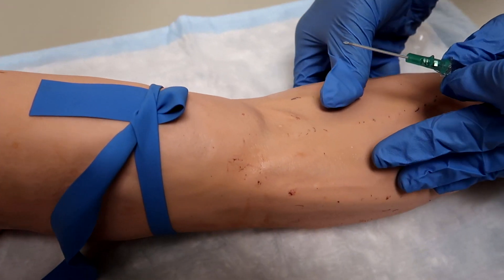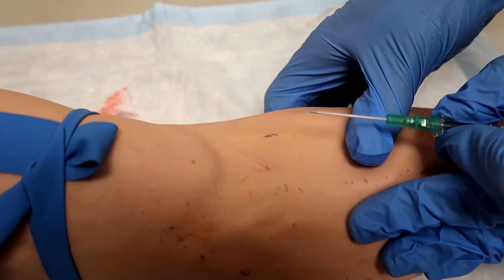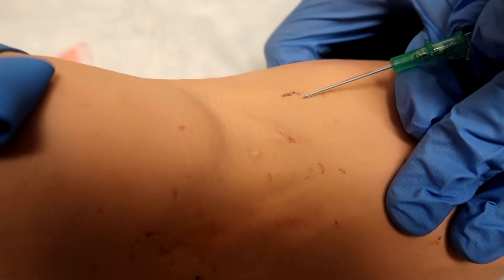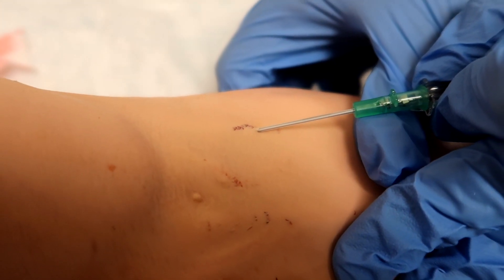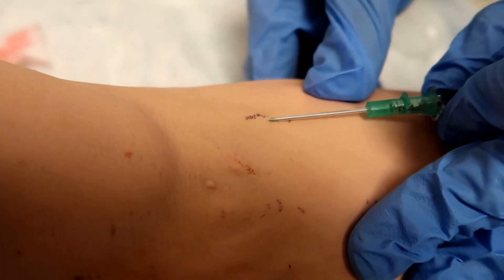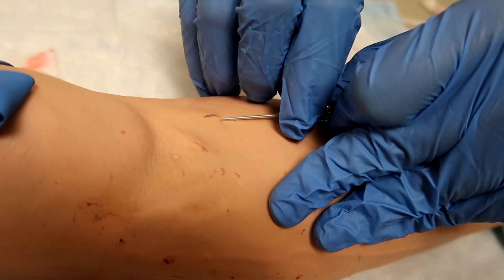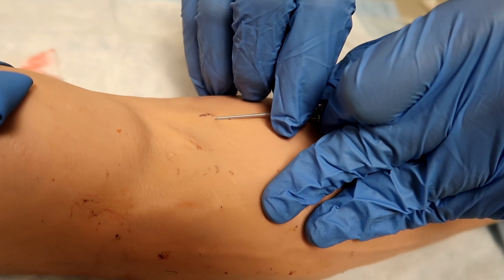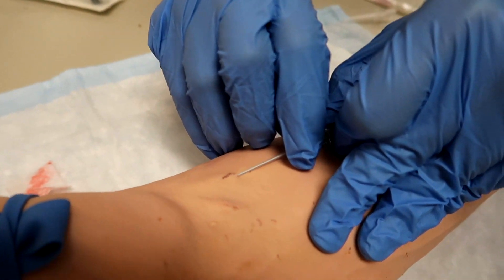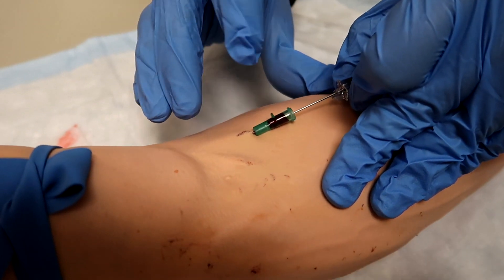Hold the skin taut distal to the venipuncture site with your non-dominant hand — when it's taut it makes the vein pop out a little more. Hold the needle at a 20 to 30 degree angle, bevel up, over the venipuncture site. Pierce the skin and advance the needle and catheter until blood is visualized in the flash chamber. Once there's blood in the chamber, drop the needle 10 to 15 degrees and advance one eighth of an inch. The reason you do this is because if you don't advance, you can try to put the catheter in and it'll jam and kink — that's a bad stick. Then advance the catheter until the hub touches the skin or until significant resistance is felt.